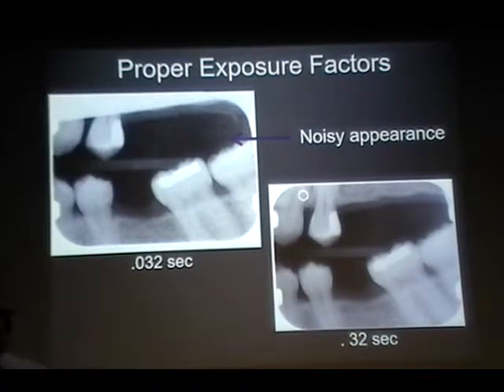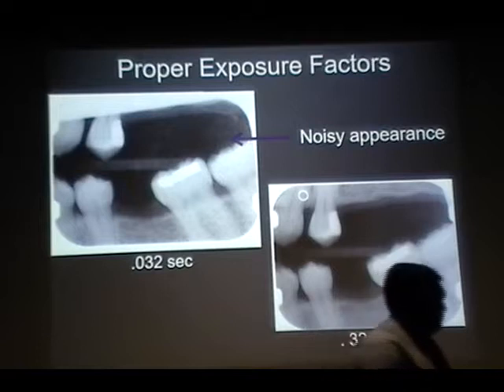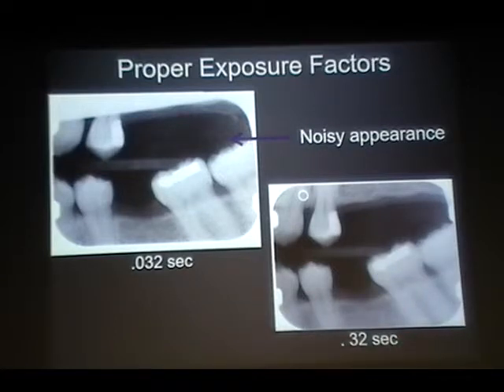With film, if you use too much exposure, the image will be completely black because there is nothing that we can control. With this auto processing, you can control. So please remember, when you are exposing a radiograph, look at the time and then expose.